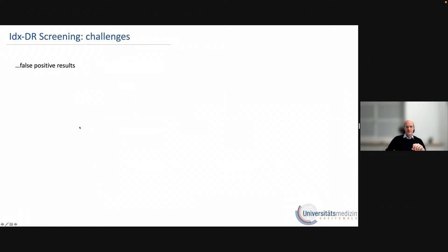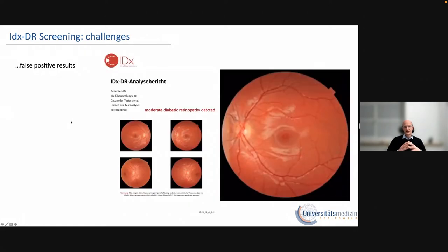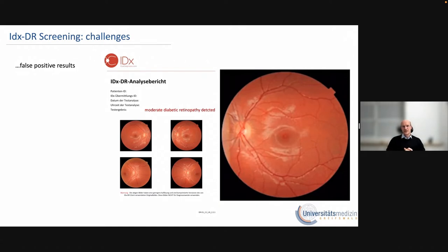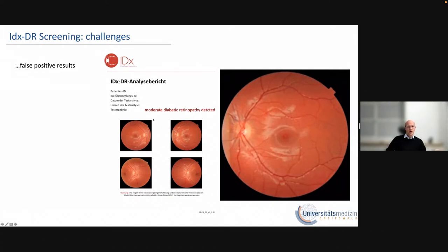If we do get images, there are some false positive results — particularly with younger patients. This is an example from a juvenile fundus of a patient who is maybe 10 to 14 years old, and the AI algorithm diagnosed this patient as having moderate diabetic retinopathy. All ophthalmologists will say this is not diabetic retinopathy — this is a normal eye of a young patient. This is probably because the training dataset contained too few younger patients, leading to errors when diagnosing diabetic retinopathy in younger patients. You have to make sure you really review the data from these AI-based systems.